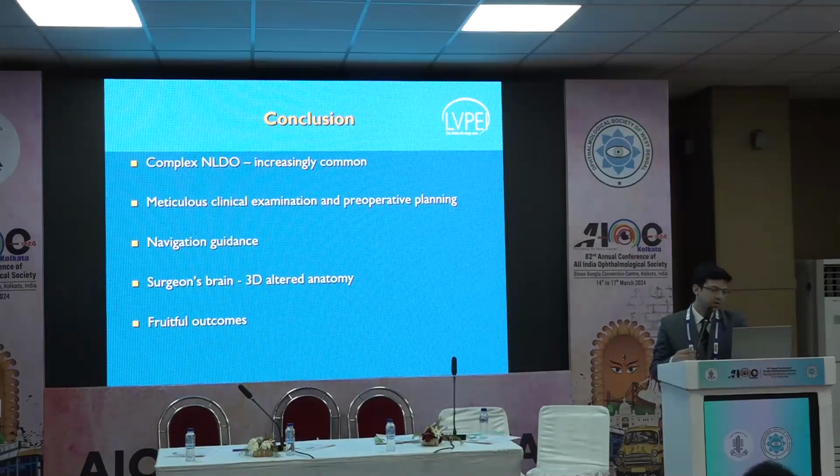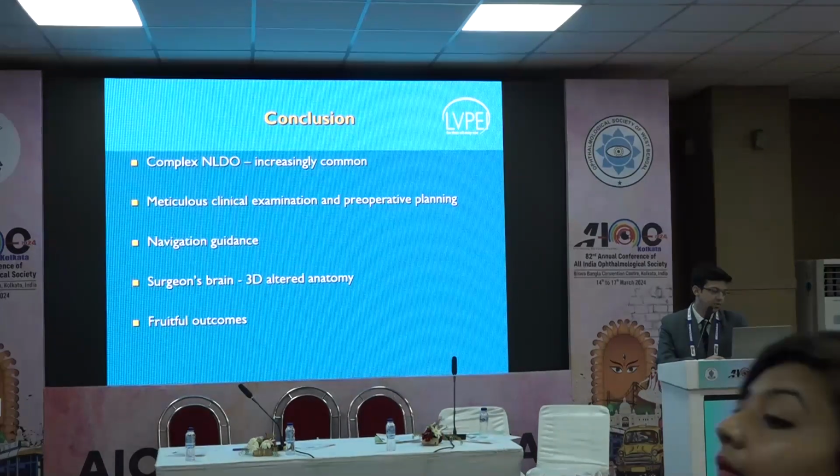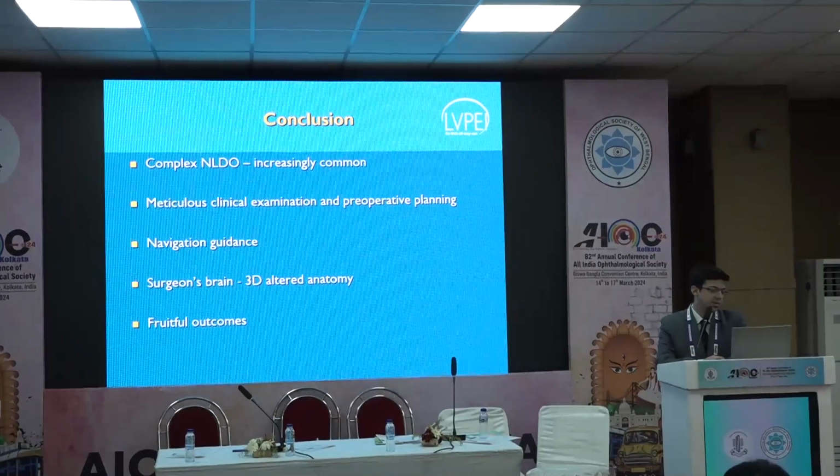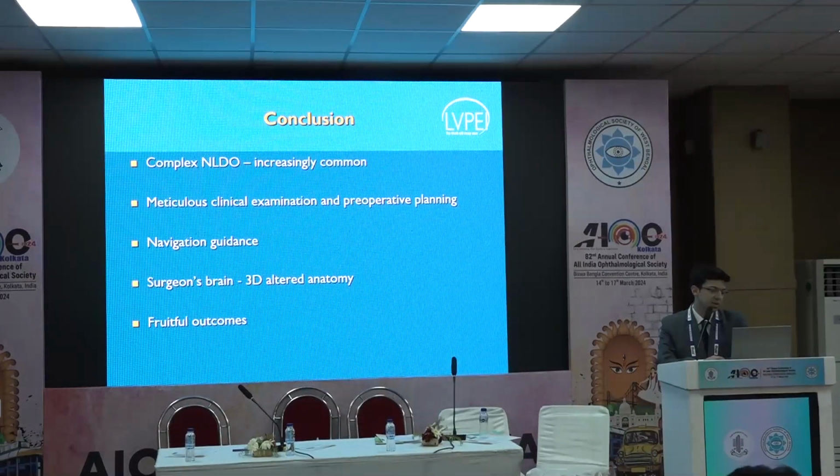So to conclude, complex NLDOs are increasingly common now, and meticulous clinical examination and meticulous preoperative planning is needed for good management of these patients. Navigation guidance is a very helpful tool. In the surgeon's own brain, he has to remember the original anatomy, and from the scans the altered anatomy of the patient, and then incorporate that into the navigation system, which can lead to fruitful outcomes.